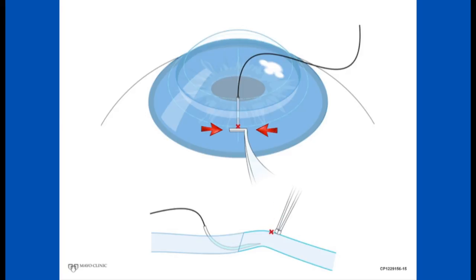The colibri is positioned on the host surface in a T position where the colibri is perpendicular to the axis of the needle and the needle tip is halfway between the two edges of the end of the colibri.